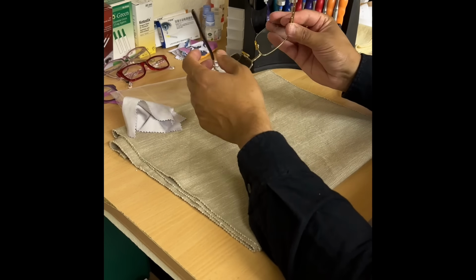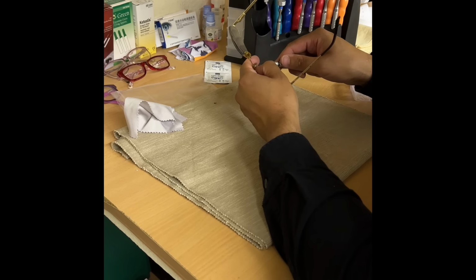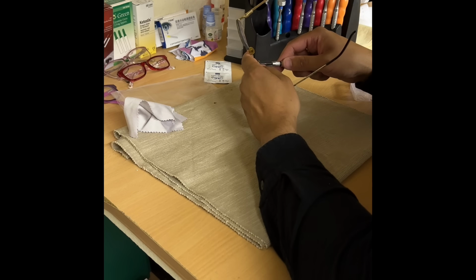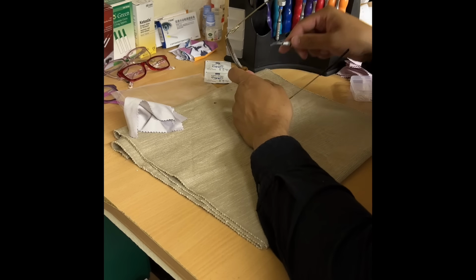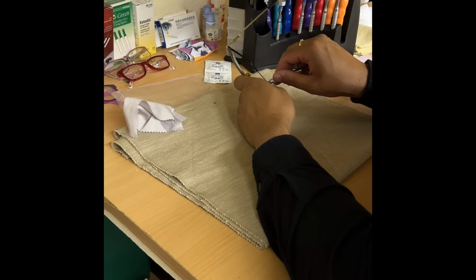And you'd like the pads changed. Yes, quite a bit of discoloration there. So this can be a tricky job replacing the pads. Have a little look. So let's take the old ones away. Okay, let's get him in there and twist, just to be careful that we don't stab the lenses.